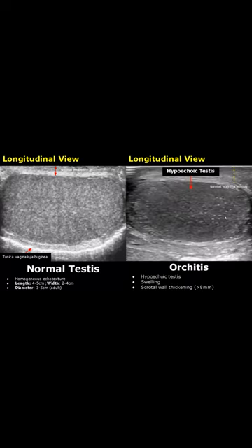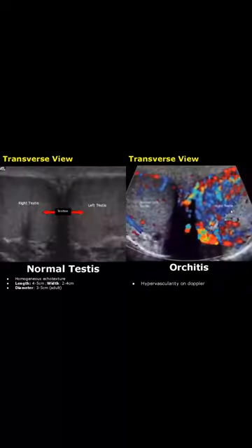Orchitis is the inflammation of the testis. The testis will be hypoechoic and swollen. Scrotal wall thickening will also be seen. On color Doppler, hypervascularity will be seen.